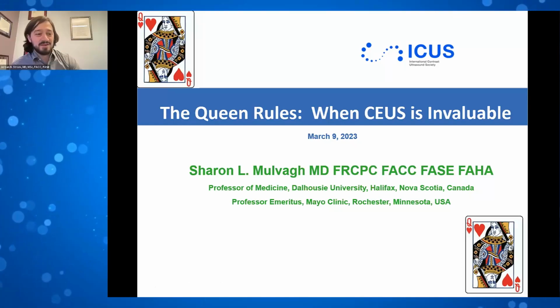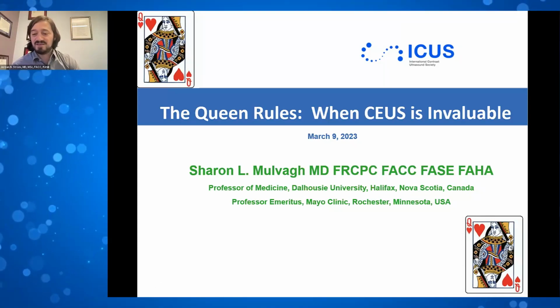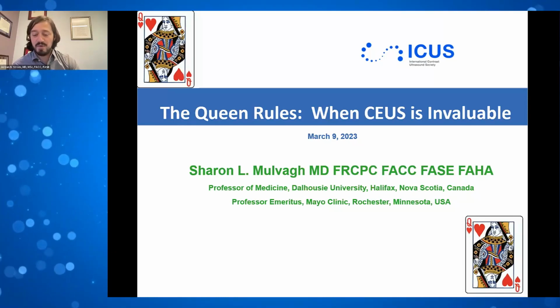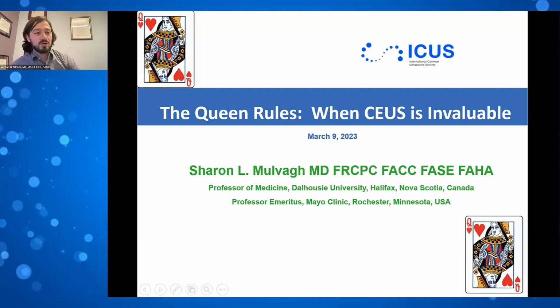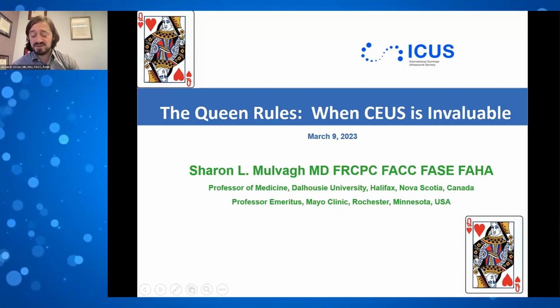Yeah, I think that's the million-dollar question here, and I think use of contrast tends to be fairly binary, in that you're either a lab that's using it and using it at a high volume, or you're not using it at all. And so there is a bit of that involved. But ultimately, I think there were sort of early concerns about safety that I think have subsequently been exhaustively tested.